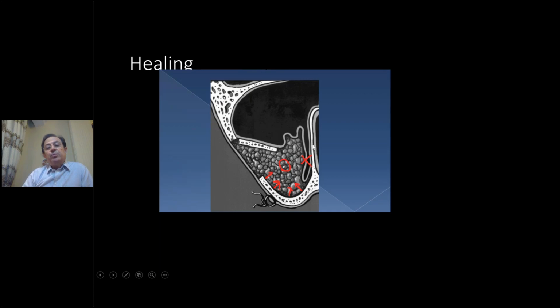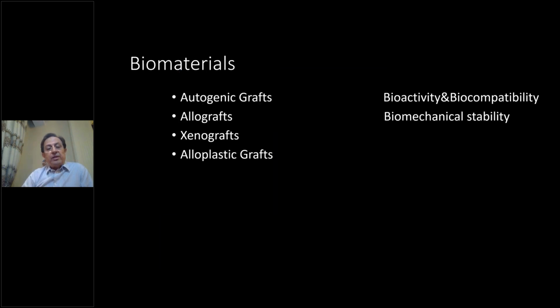So it's better to lift completely, and the healing and blood supply start from the surrounding area, and the center of the graft is the last portion that will revascularize.